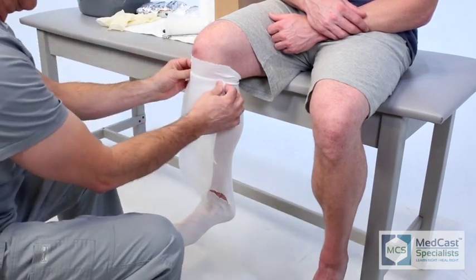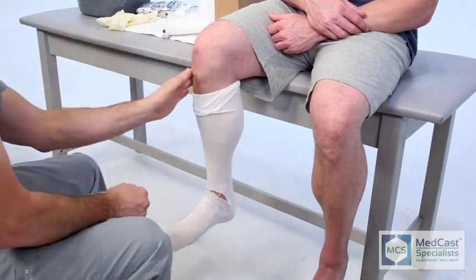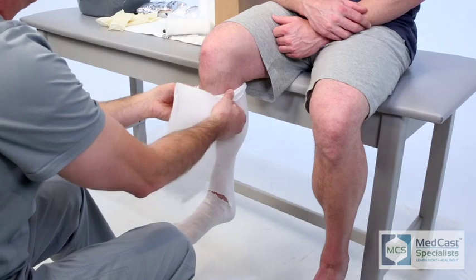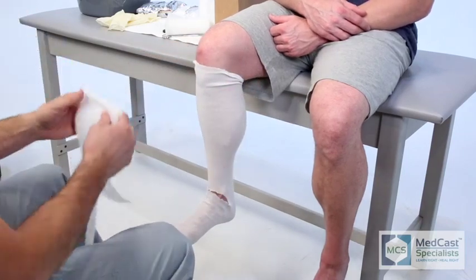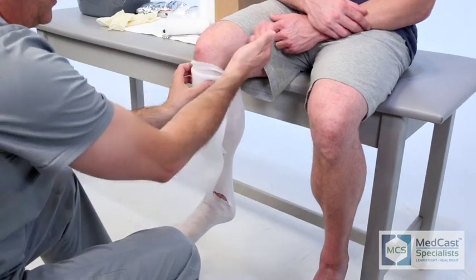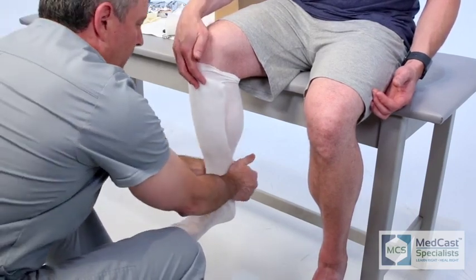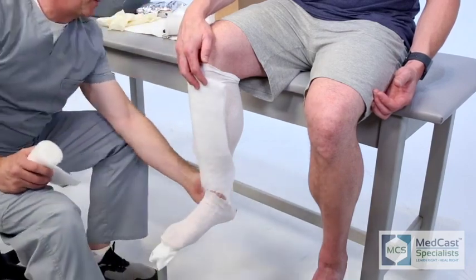A prominent area on your lower leg is your tibia, your shin. There's not a lot of soft tissue there, so he's showing how you can put an extra layer of padding there to start with — that way you don't have to wrap as much around the rest of the leg. The other important bony landmark he's pointing to is the fibular head. Make sure you do not go up with your fiberglass on top of the fibular head; you want to stay at least two or three fingers distal to that so you're not pinching off the peroneal nerve and causing a foot drop.